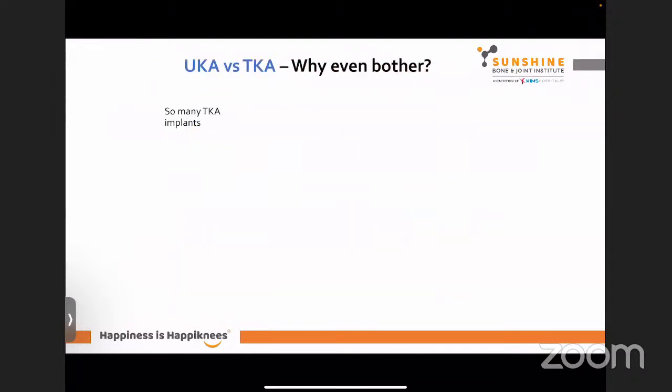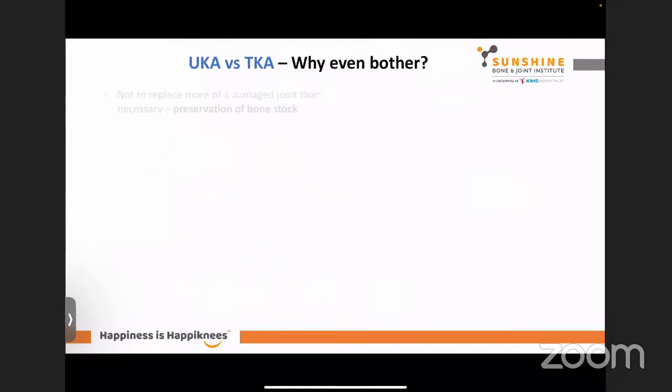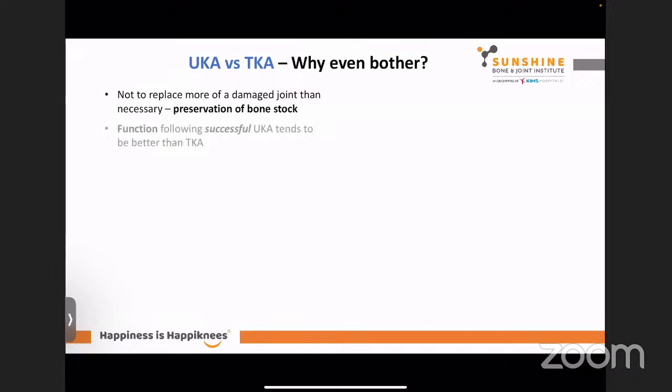So why do we bother? When you have good TKR implants all over, from different companies, you have rotating platforms, now the medial pivot knees, so many beautiful implants, why even bother with this half a knee? There are many reasons for this. You're not replacing more of a damaged joint than is necessary, so you're preserving bone stock. This will definitely help younger patients who have only medial arthritis.